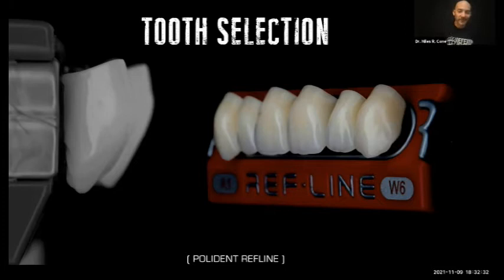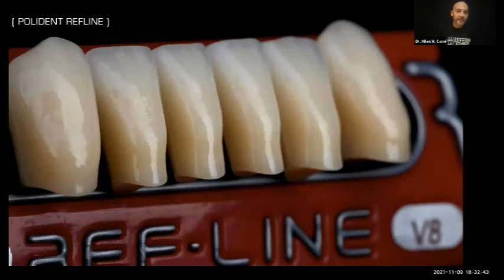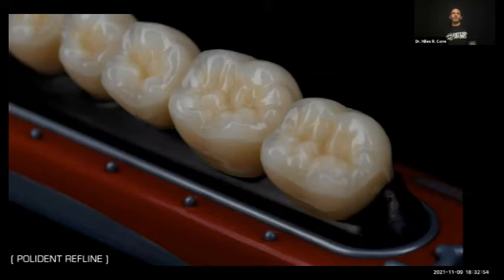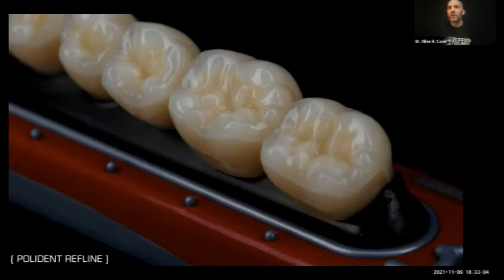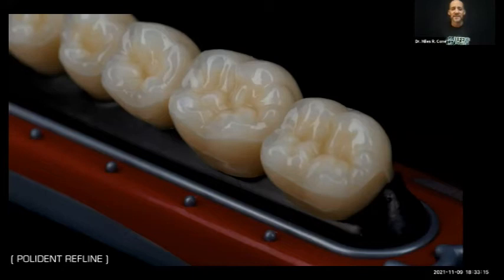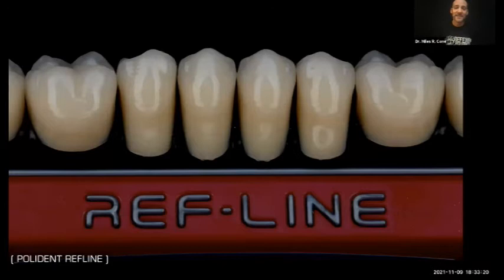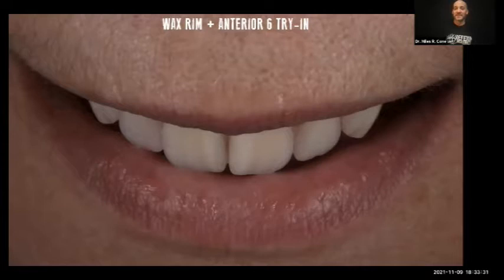The teeth I really like are by a company called Polydent in Slovenia — I don't speak for them, but I use these because of canine guidance. Look at how aggressive and gnarly these canines are. I like teeth that look like teeth. I generally don't think most denture teeth look like real teeth, but these have gorgeous topography with peaks and valleys. I make all my dentures canine guided — every time I set teeth like this, there are no problems. Even with resorbed mandibles, I'm not setting zero-degree teeth, and I haven't had any issues setting teeth that look like real teeth.